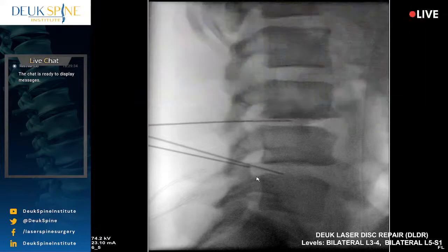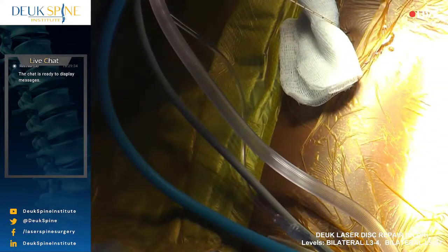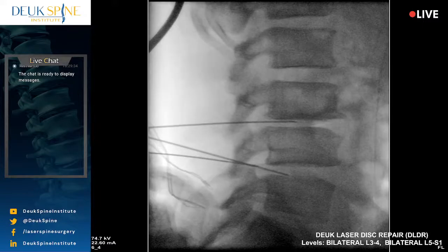And yeah, right there. And look, show them where the facet joint is. The superior facet. Yeah, no, that's the joint. You're right. Come to the superior facet of 5. Yes. Show them the anterior margin of that facet. Yes. Look at, there's almost no space between the herniation and that facet. Huge herniation. We're going to get rid of that thing. You okay? Any pain in your leg? Good. Yep.